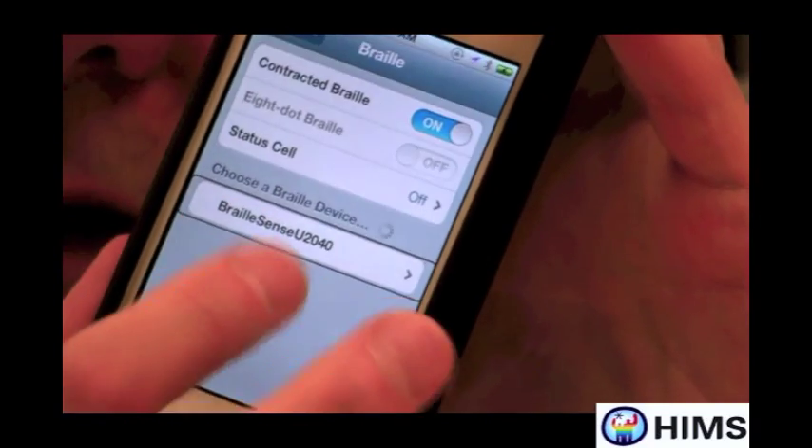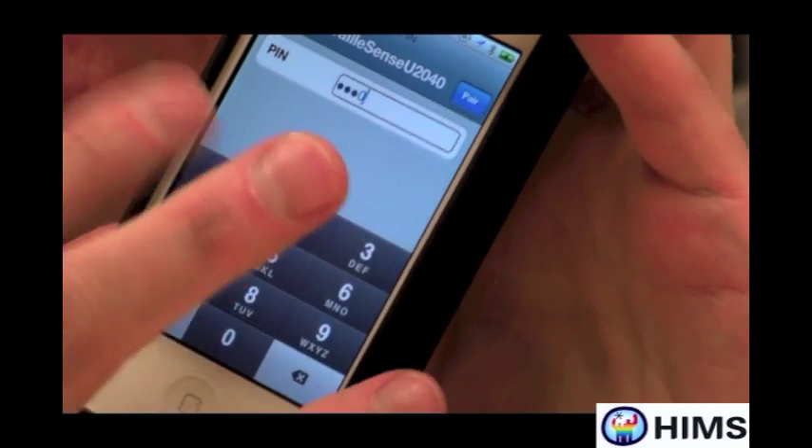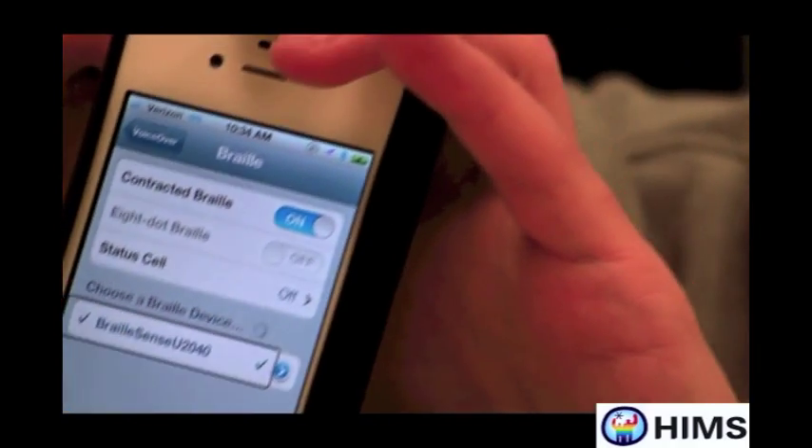So I'm going to double tap, and it's going to ask me for a PIN. I'm going to enter zero, zero, zero, zero, and press the Pair button. And there it is — the two are now connected.